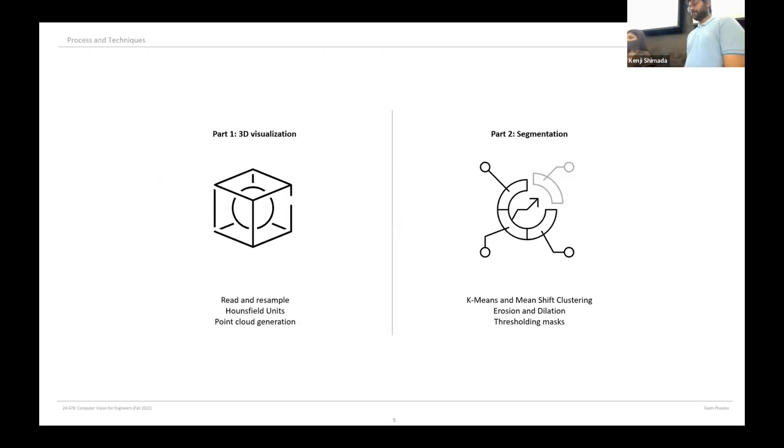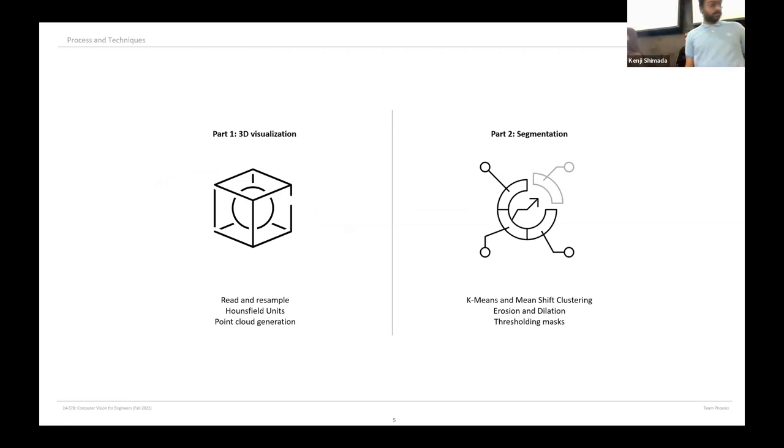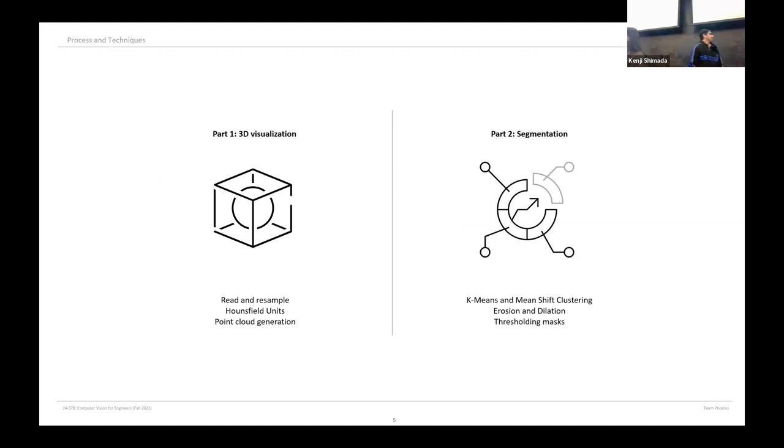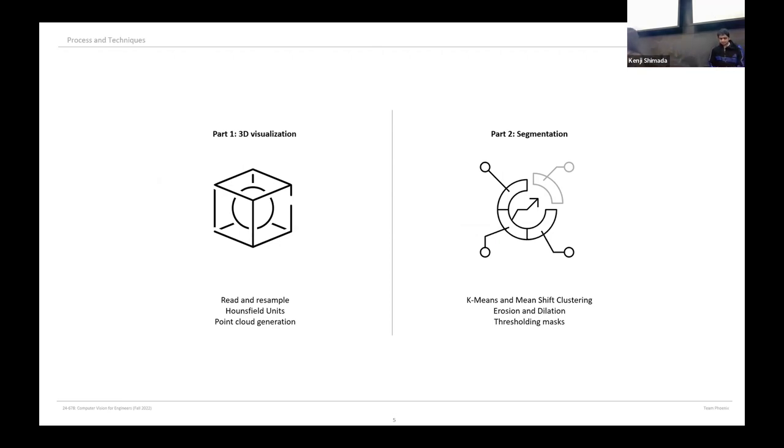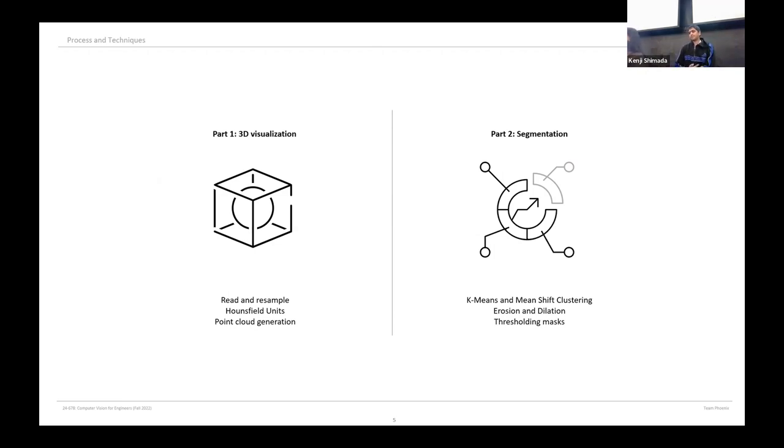Our project is divided into two parts: visualization and segmentation. We introduce a simplified workflow with geometric transformation such as resampling and point cloud generation for 3D visualization of the DICOM data. Then we utilize feature detection techniques such as clustering to showcase applications of tooth segmentation and decay analysis.